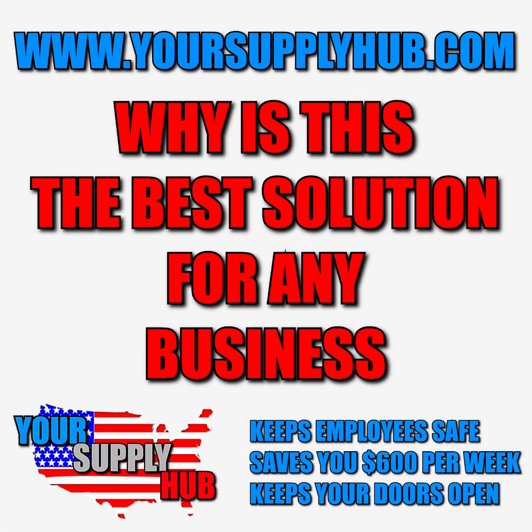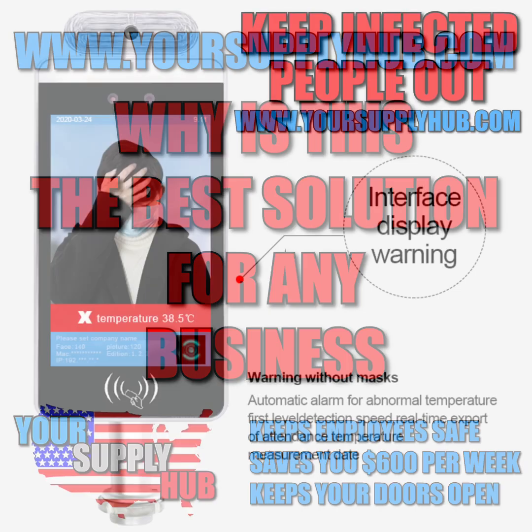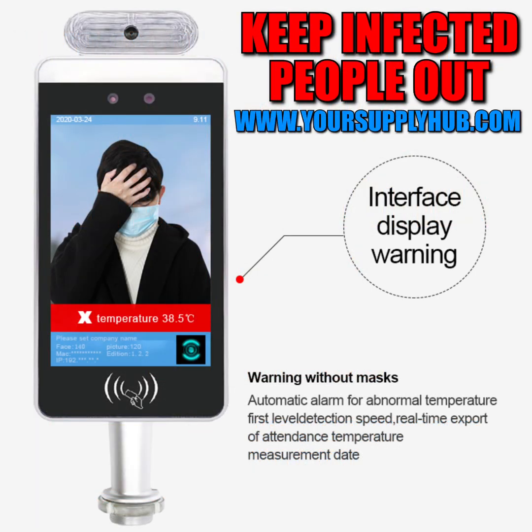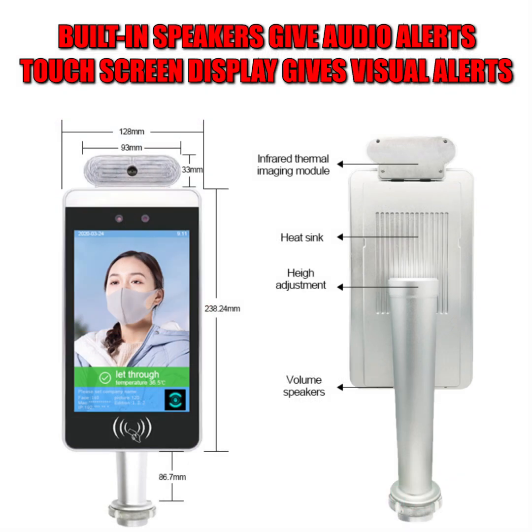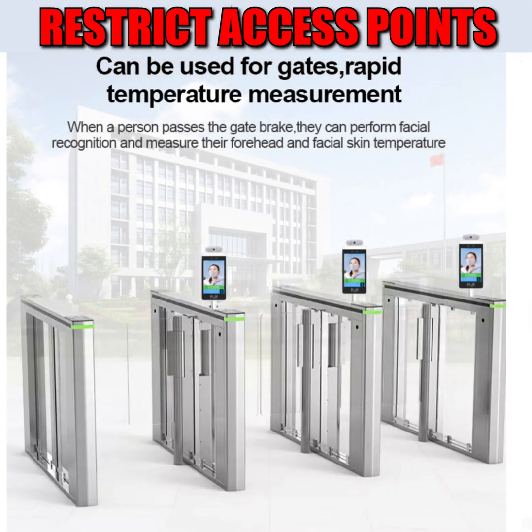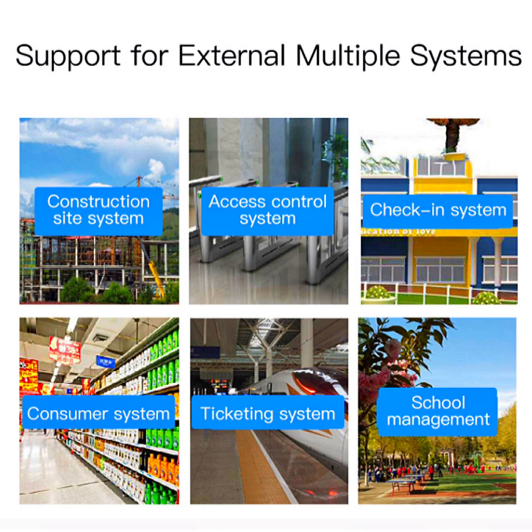Hey guys, my name is Ryan, welcome to your supply hub. I'm going to give you a little bit of information about this product and why we think it's such a great solution for any business. Your first line of defense after PPE is temperature scanning. Even though they find it to be relatively ineffective, it is one preventative measure that you can implement in your business that seems to be really working for other customers.